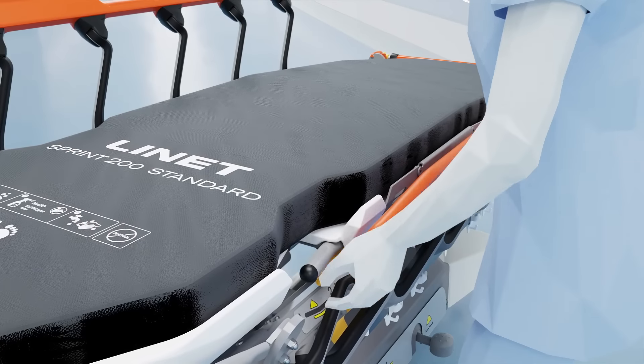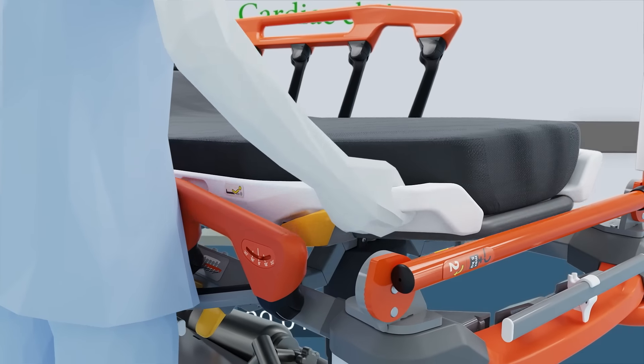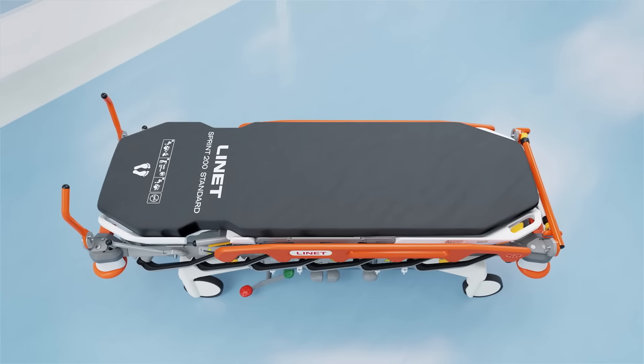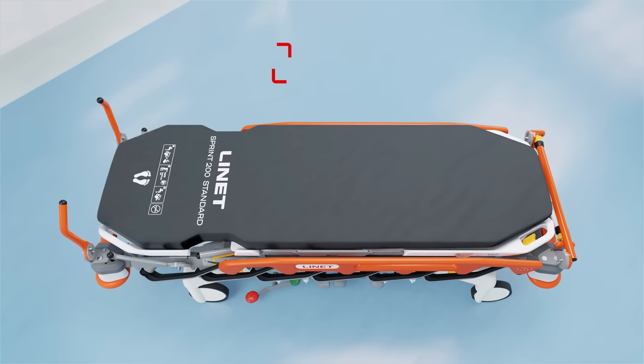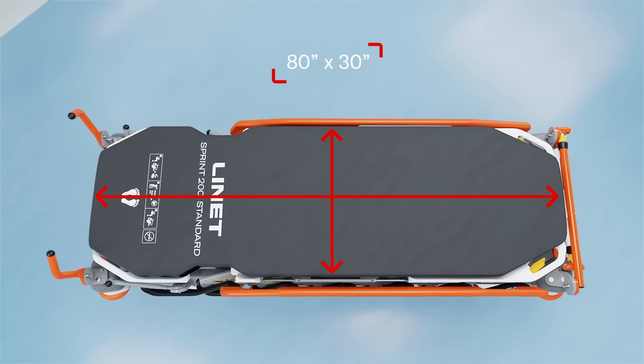To immediately help with vital functions on the stretcher, patients can be moved into a cardiac chair position or many other helpful positions. The Sprint 200 provides a mattress platform to comfortably accommodate patients of most sizes without any accessories.